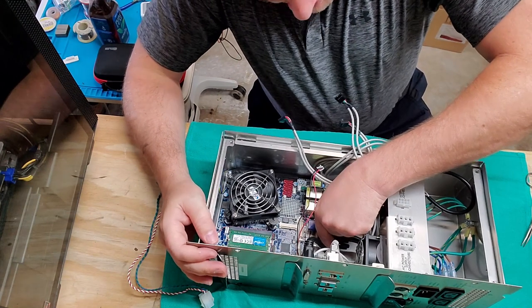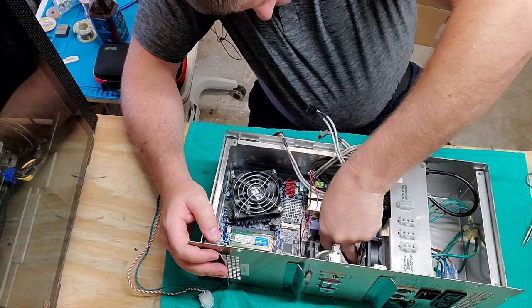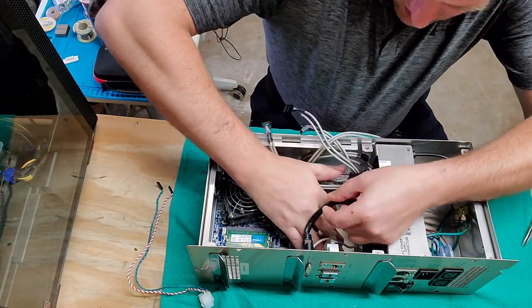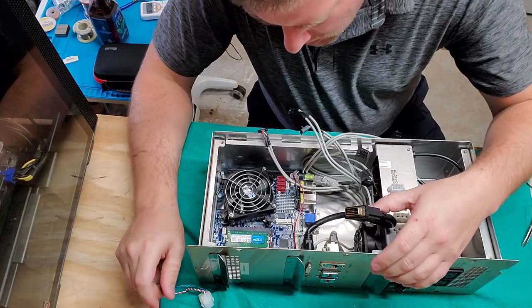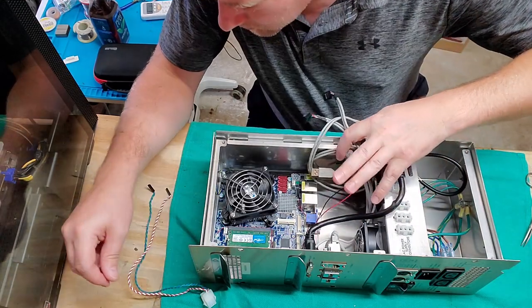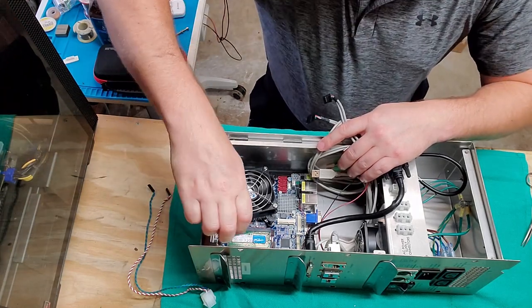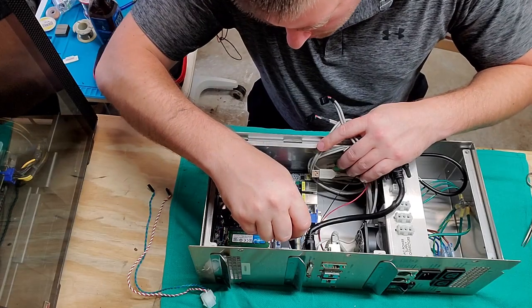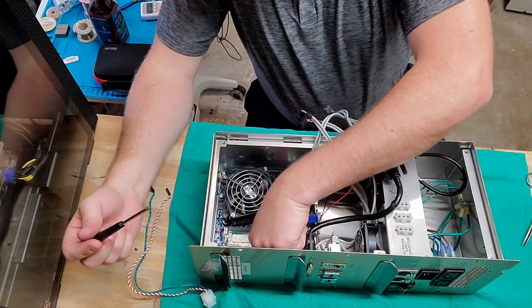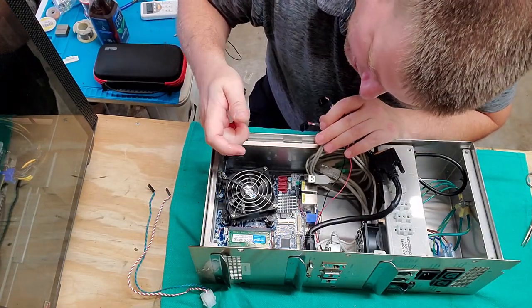All right, I'm trying to get this DVI cable out. Wow, that is a beastie little DVI cable too, let me tell you guys. Look at that guy. All right, so, let's see. Audio, some USBs. Let's go ahead and unplug this guy. Yeah, be really careful if you ever go into any of these stamped PC cases like this one. It's very sharp. All the edges are extremely sharp. And I'll probably get cut up.